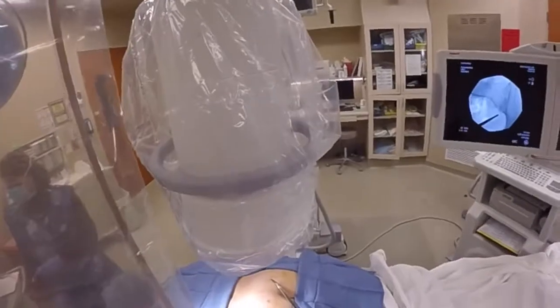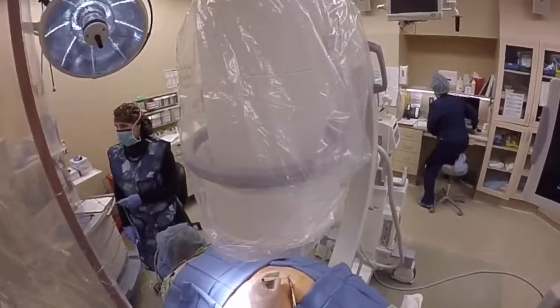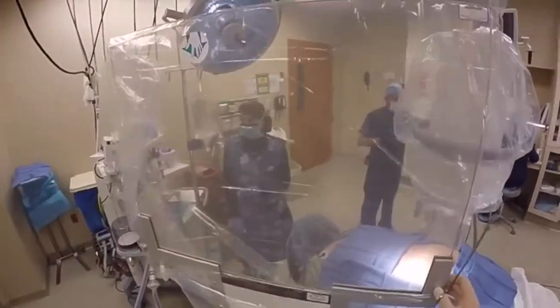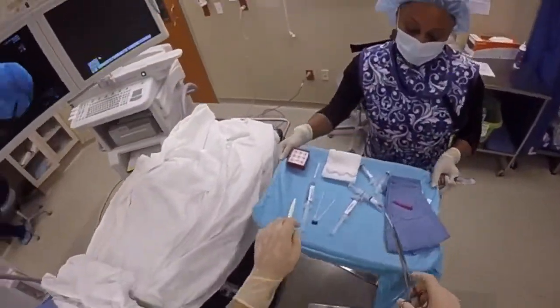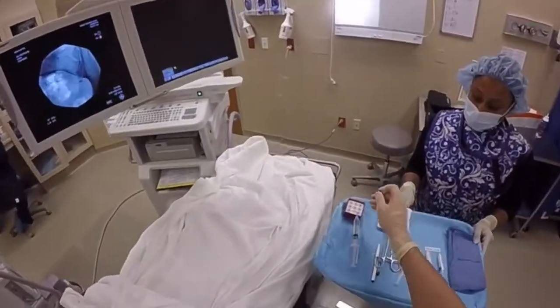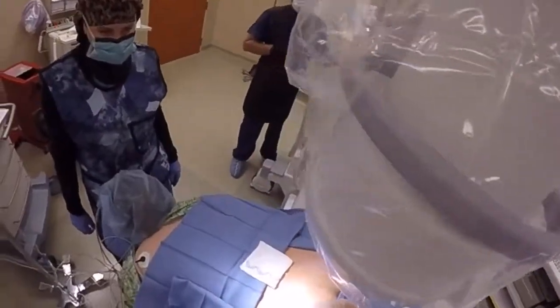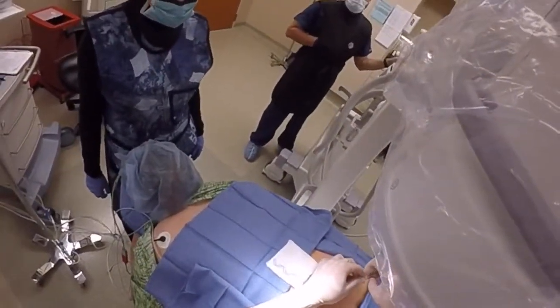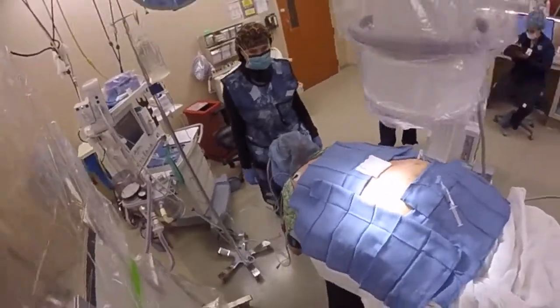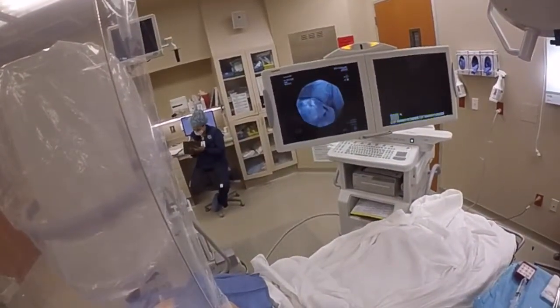We utilize fluoroscopy and the technique described in the journal Anesthesiology in 2003. Under fluoroscopy, a 22-gauge 3.5-inch spinal needle is advanced until the lower inferior border of the sacroiliac joint is touched, and then walked 1 cm caudal and 1.5 cm lateral into the substance of the piriformis muscle.